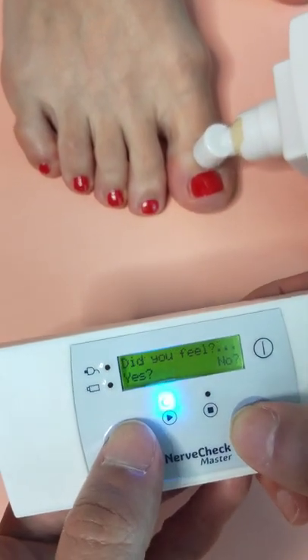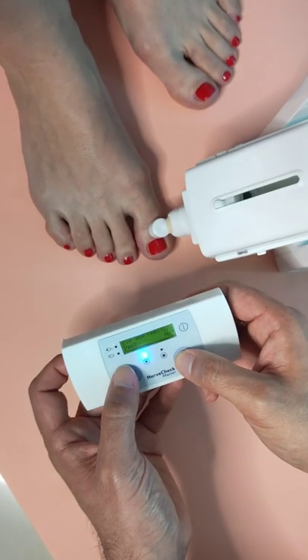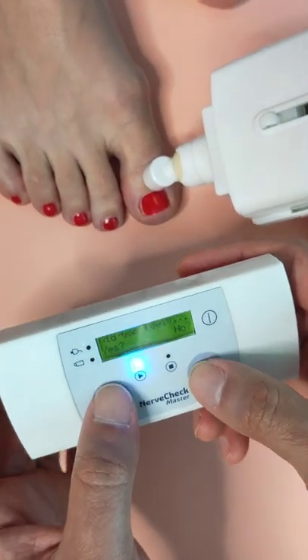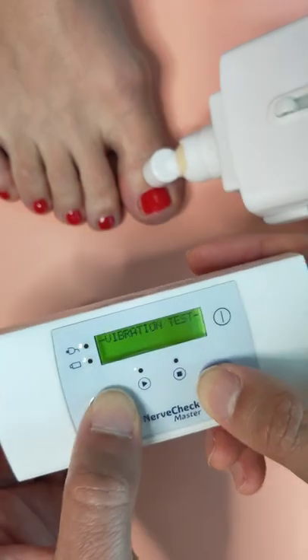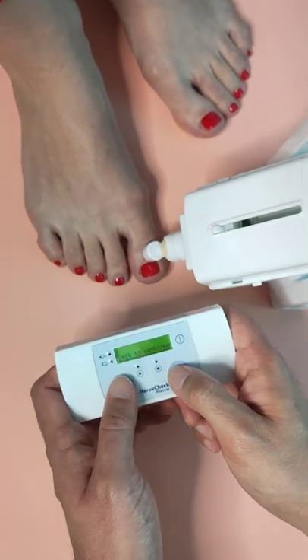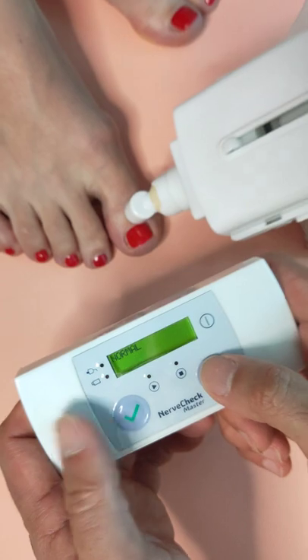Did you feel it? No. Now? Very little. If you didn't feel anything you should say no. You felt nothing or a little bit? A little bit. Oh, it fell — you felt it. And the results are normal.